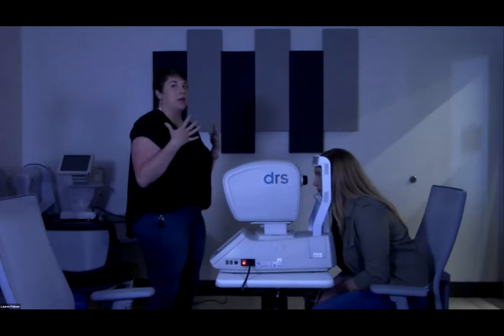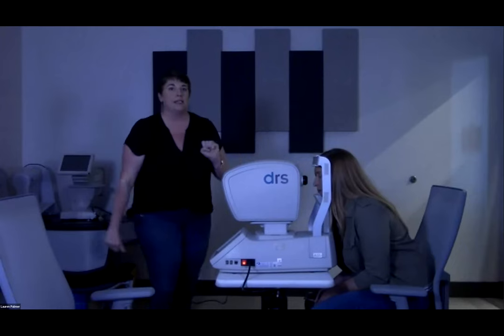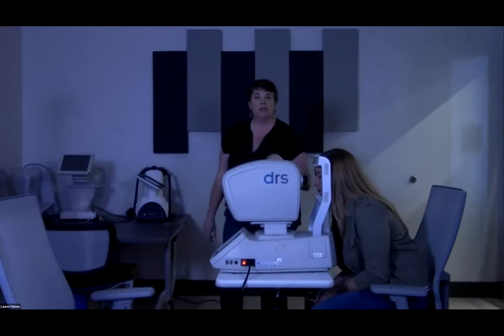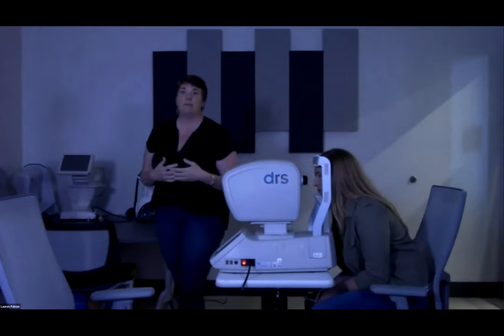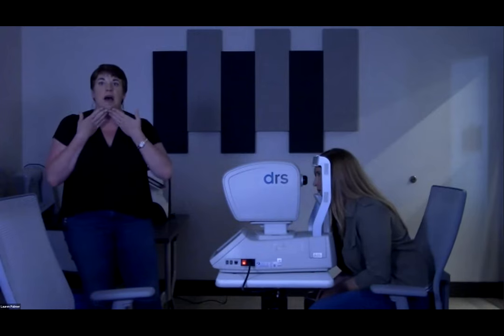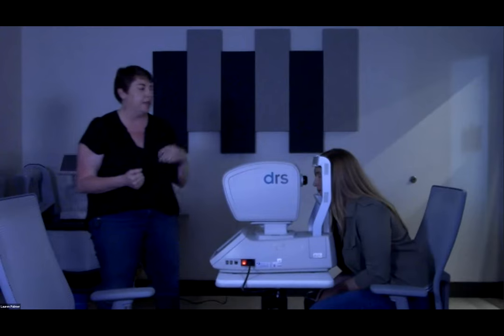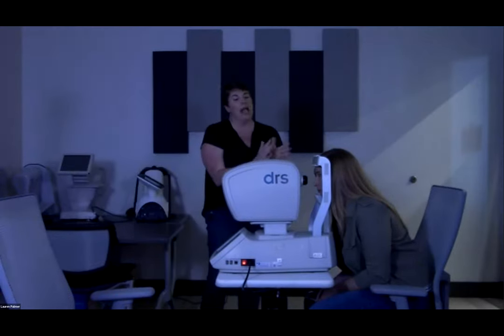So you want your patient to come forward and slightly down. This way they can place their forehead all the way against the bar. You also want to make sure that their chin is centered in the chin rest. This is another time that masks can make it a little bit more difficult for patients to understand where they're positioned, because the mask might be covering their chin. It's very helpful to come to the side and look at your patient.